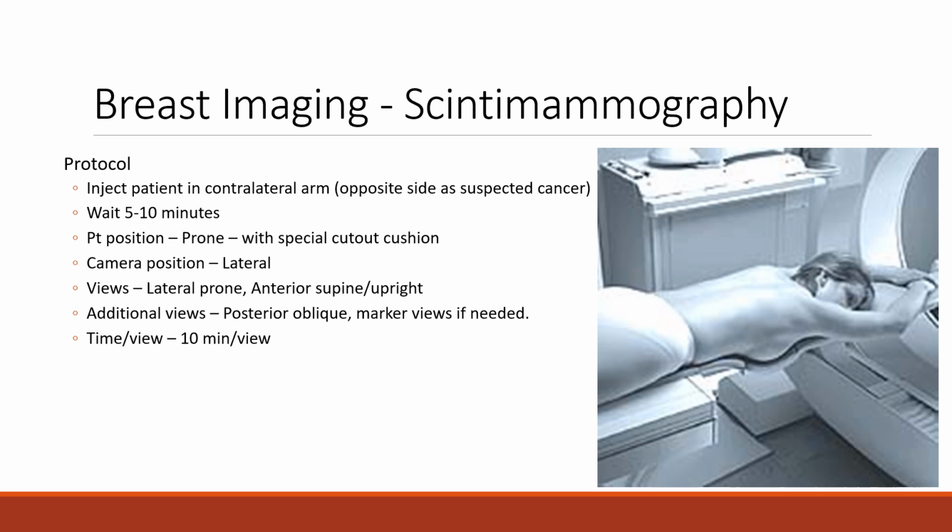So the protocol, you inject the patient in the contralateral arm. This is important. You want to do the opposite arm from the suspected cancer. Wait 5 to 10 minutes and then put them prone. This is the holder for it.